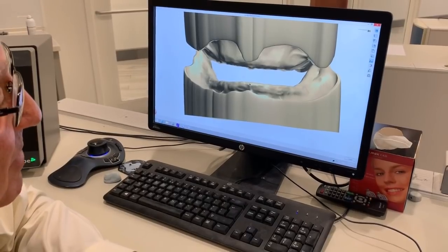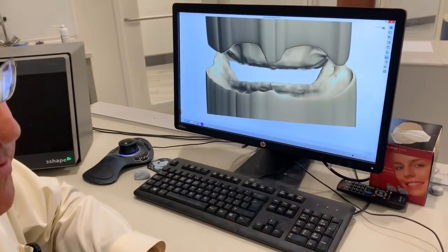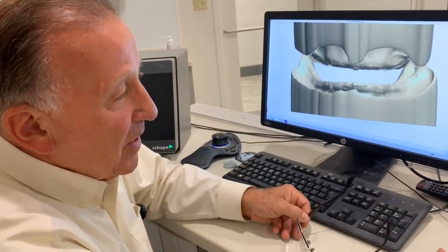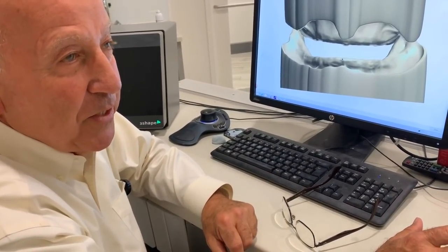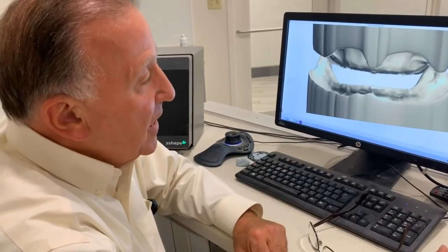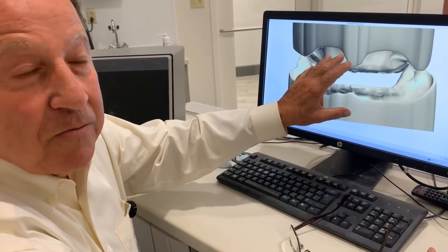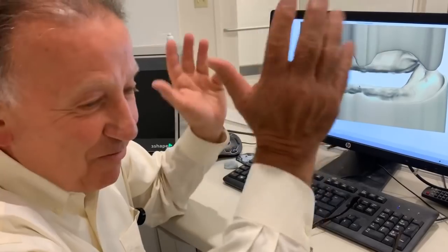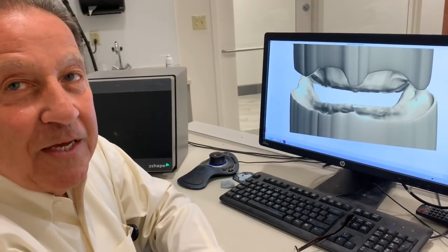One of the things we didn't talk about, which I think is probably one of the key services of this technology, is the fact that once we're done, and let's say we make a very satisfactory denture, with teeth that you like and in a position you like, then we'll have this electronic memory. So that you walk out of here and a dog bites you and the teeth fall out and runs right off with them. You could come right back in and we press a button, and you could have teeth that are exactly the same. Oh, wow.